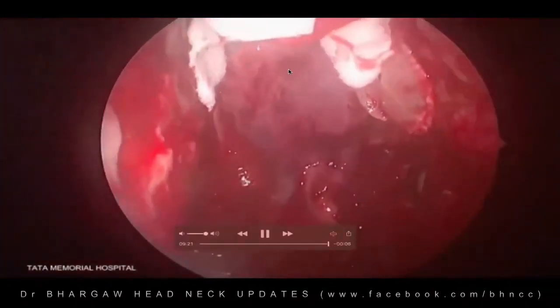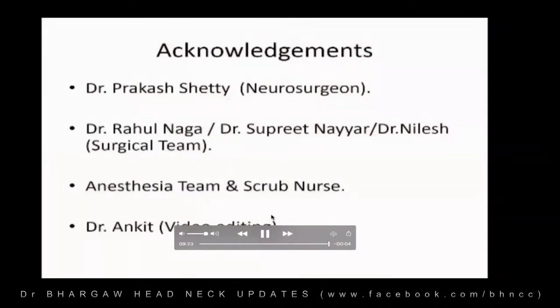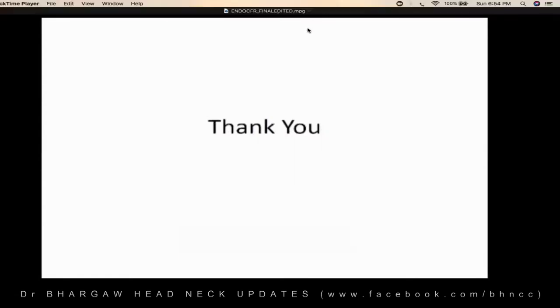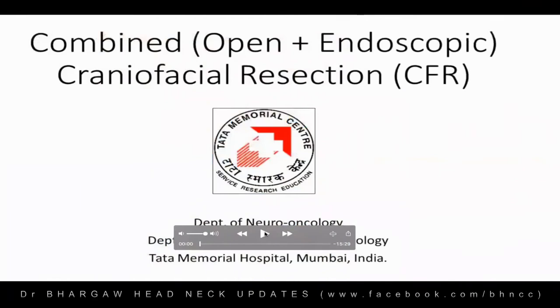So the Hadad flap is put there, and you pack it well with gel foams, and we definitely do put the Merocel pack for at least 72 hours, and then remove the Merocel pack. So this is a combined craniofacial resection. This is open with endoscopic.